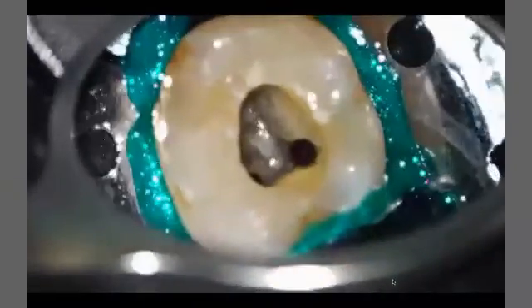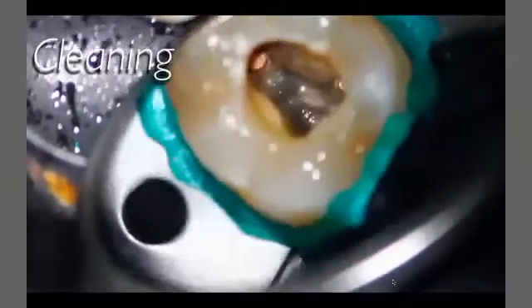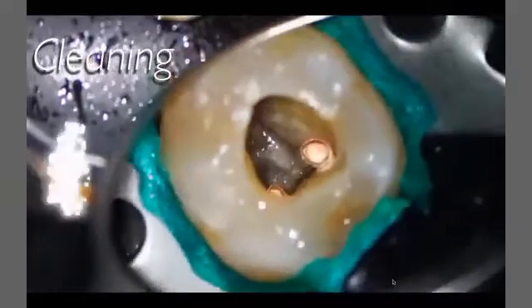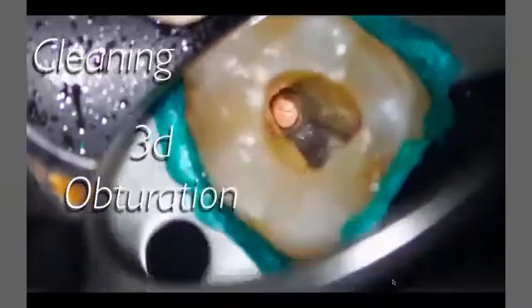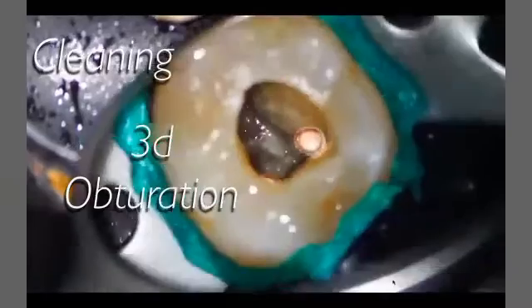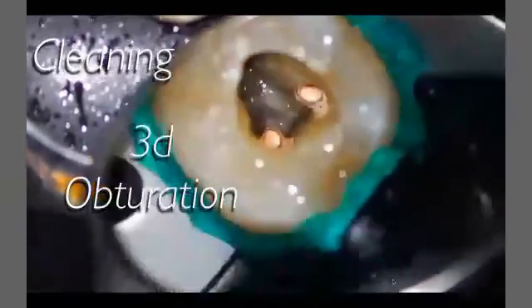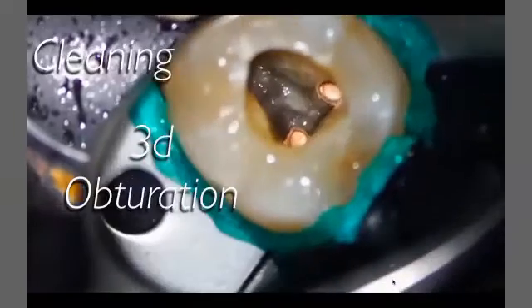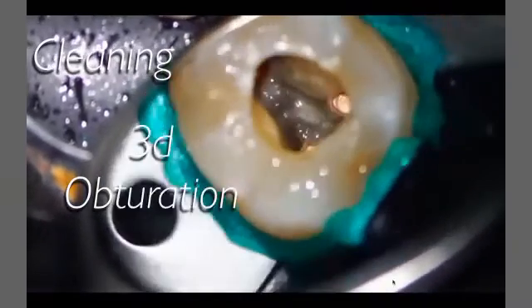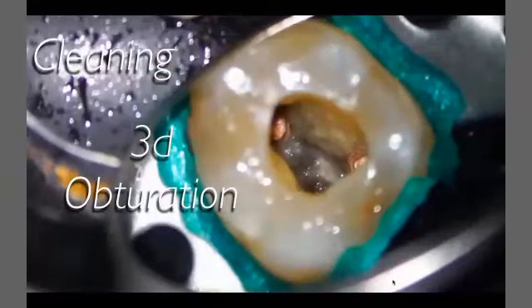On the axial wall, we have bright dentine. On the floor map, we have the dark dentine. So the floor map is there, we just have to search for it. The colors are there. We just have to magnify as much as we can, dry as much as we can, and remove the bright dentine and the calcification. Then 3D obturation as normal, continuous wave or warm vertical condensation or compaction.